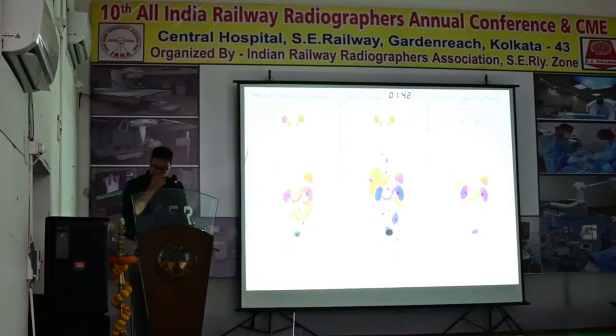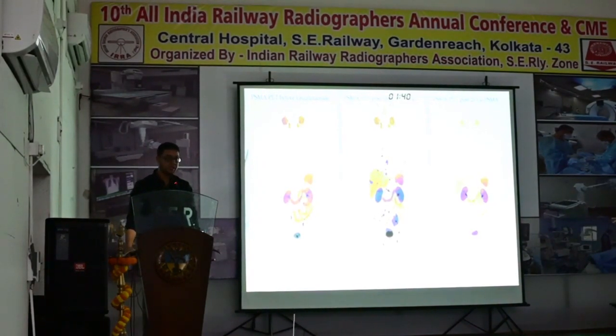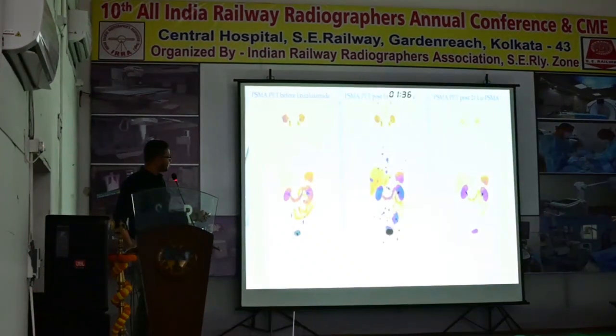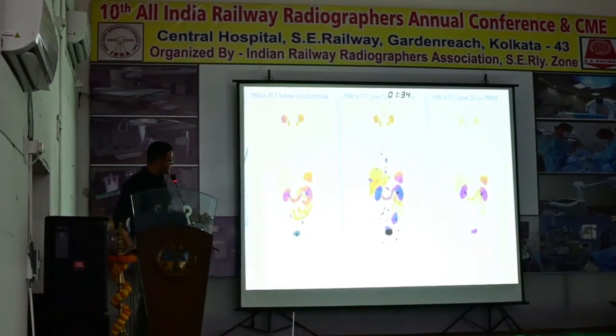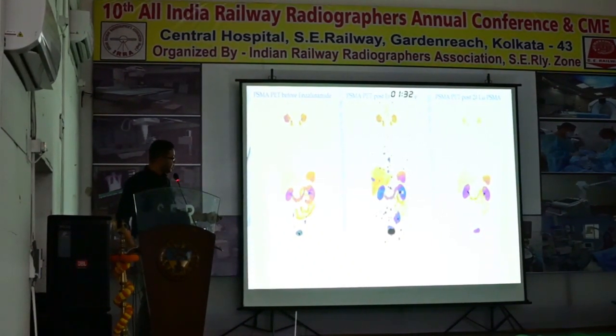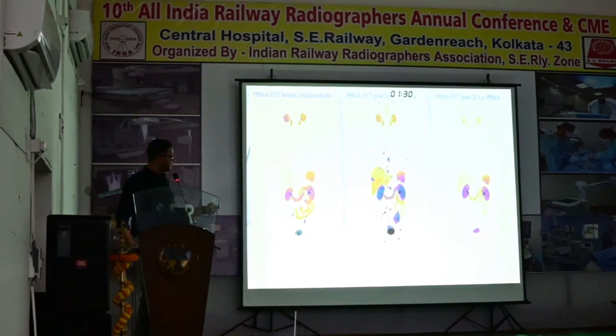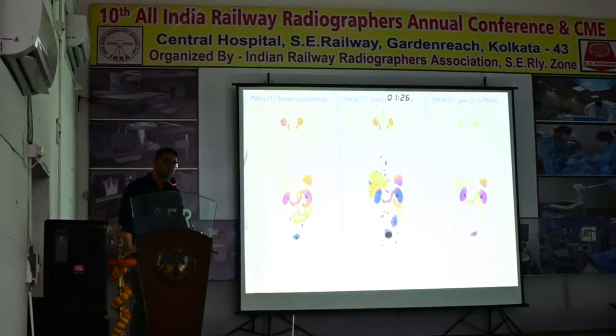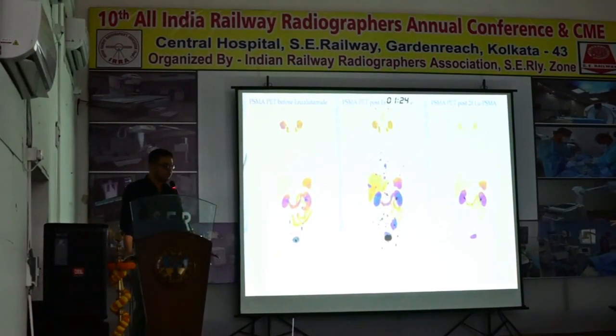This patient was sent to me for LU-PSMA therapy after progressing on enzalutamide therapy. So this is the PET CT before enzalutamide. After a few months of enzalutamide, PSMA PET CT showed significant progression of the disease. We treated him with 2 cycles of LU-PSMA.